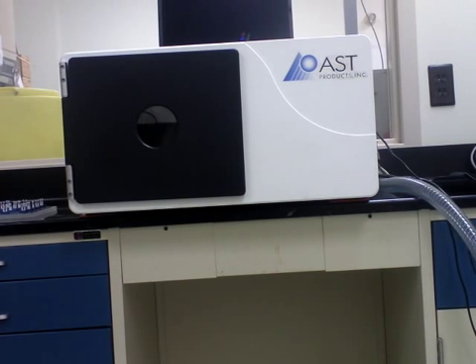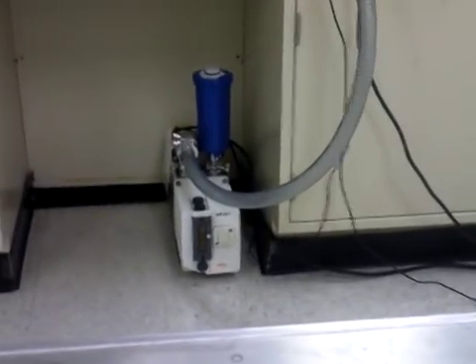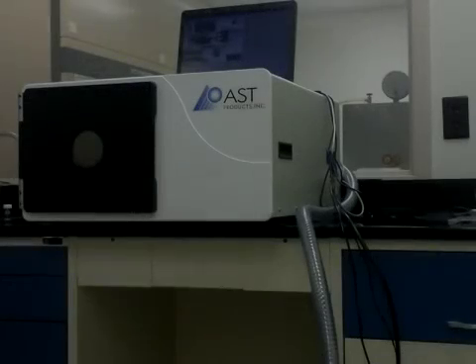This video is going to show how to plasma treat contact lenses in the PJ plasma system. As you can see, in front of you is the PJ unit, above it is the laptop that runs the software, and below the lab bench is the pump that comes with the PJ system.